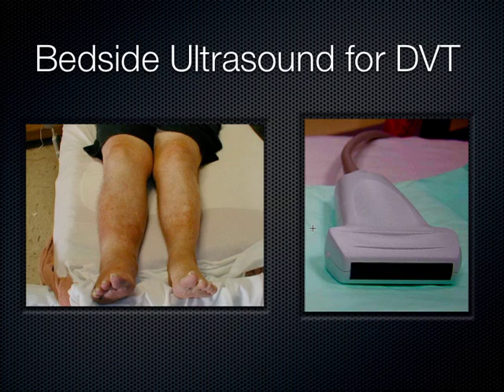The linear transducer in these cases, of course, is sometimes referred to, some people call this a vascular probe, but we can use it for so many more things than just blood vessels. And what's the biggest blood vessel in the body? The aorta. It's a deeper structure. You wouldn't want to use this probe on the aorta because you've got to get the sound to penetrate all the way down to the spine, basically, to see the aorta. So that's why I don't really like calling this the vascular probe, because it's got so many uses and you wouldn't want to use it on the biggest blood vessel. So I always call it the linear probe. But just so you know, you might hear someone call this the vascular probe. And it's the one with the highest frequency.